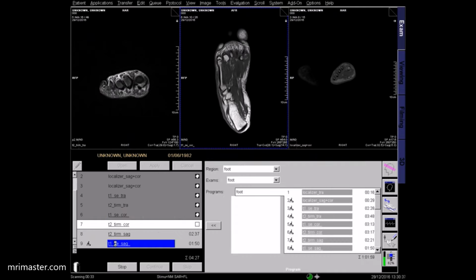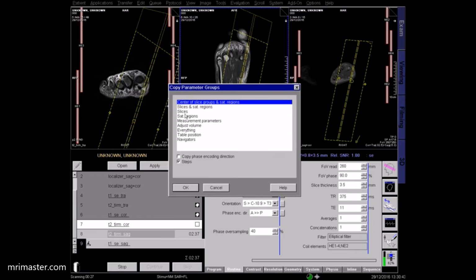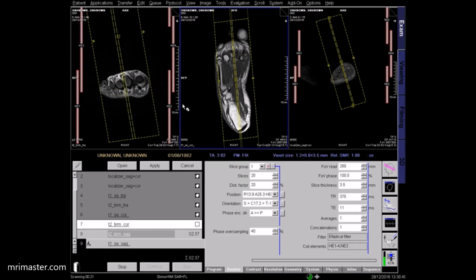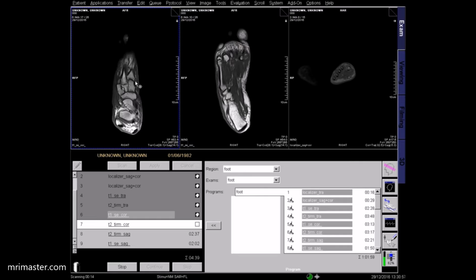For the second sagittal sequence, copy planning and measurements from the previous sequence. Check the planning in all three planes and apply. Now let's look at the coronal images. In this T1 coronal, we're again assessing image quality and ensuring coverage from the dorsal to the plantar aspect of the foot.